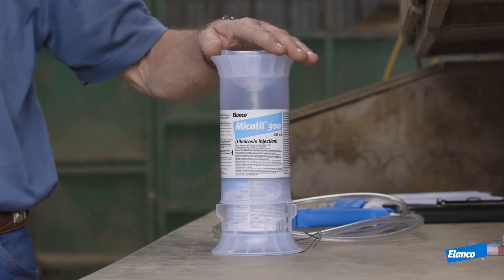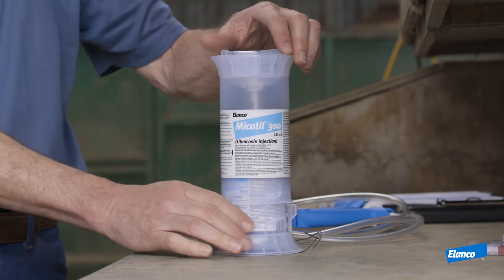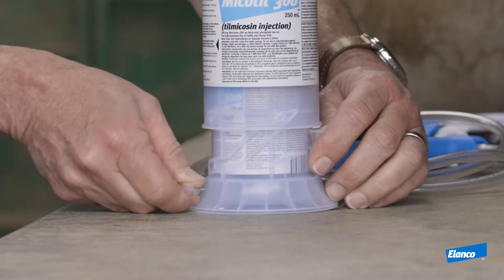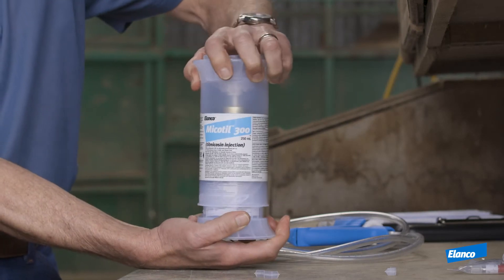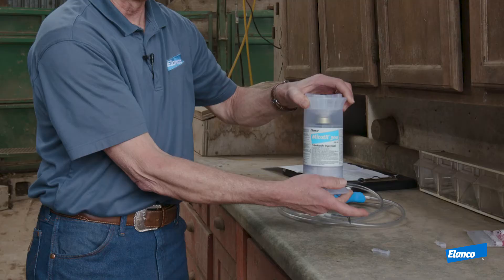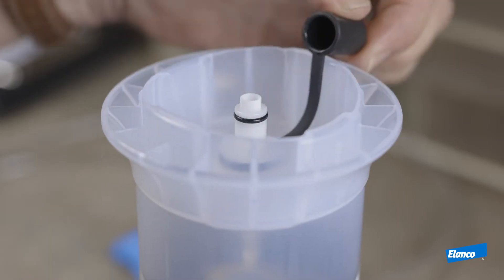Today what I would like to demonstrate is the new Mycotill shroud that pairs with the safety syringe. The first thing we want to do is put the shroud on a level surface and take these two safety tabs and pull them off of the side of the shroud. Now we take our hand and put it on top of the shroud and twist clockwise — the shroud is going to click into place — and we're going to take the black rubber topper off of the top of the shroud fitting.